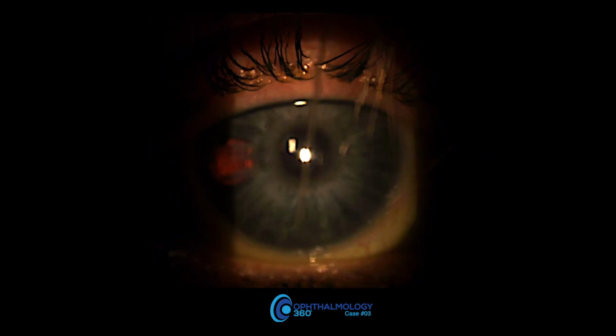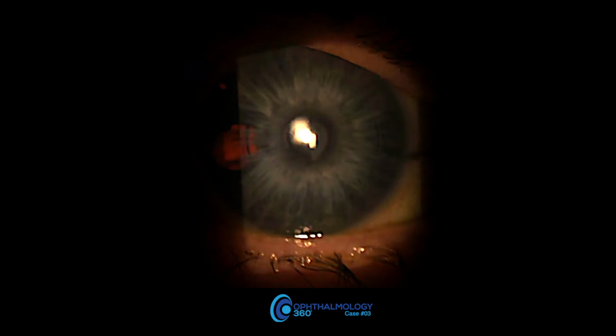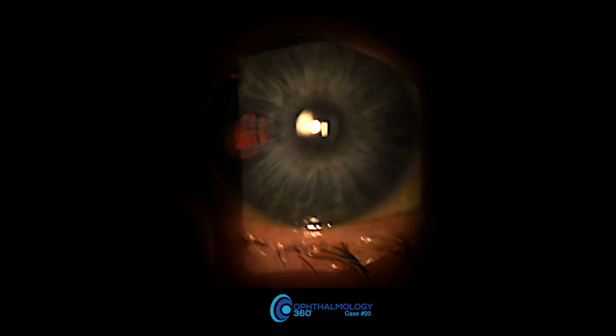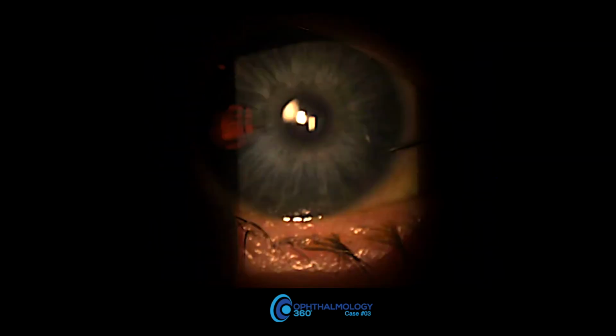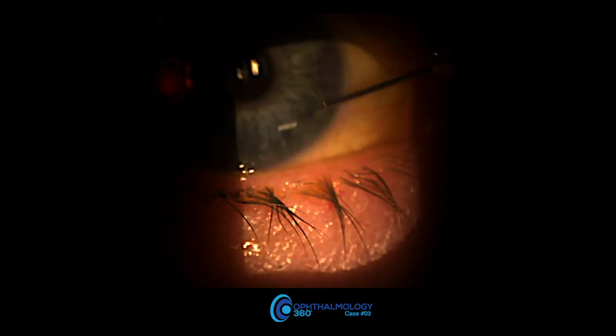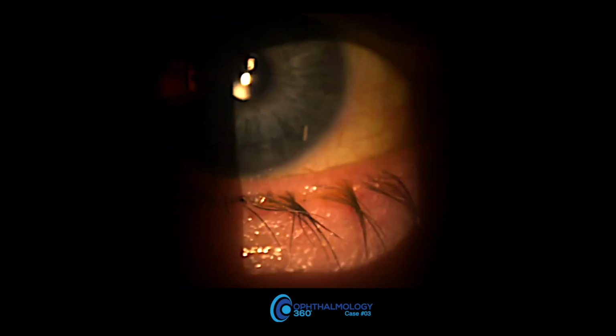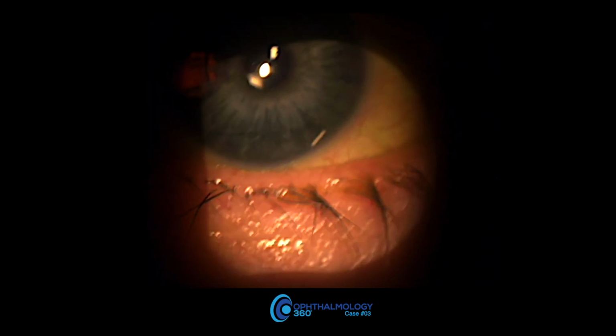Here's a patient that was on 5 drops. I've been following for 20, 30 years. You can see she's had a goniotomy. She also had a lot of posterior pressure at the time of surgery. She's got a little iris atrophy at the wound, and she is now off 4 medications with the bimatoprost.